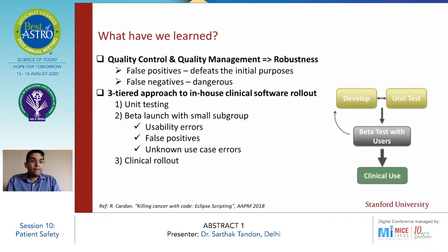In regards to quality control and quality management, what they found is that the DMAIC feedback loop was instrumental in getting their dosimetry support. Because of that exhaustive DMAIC feedback loop, their entire result propagated into an effective output.